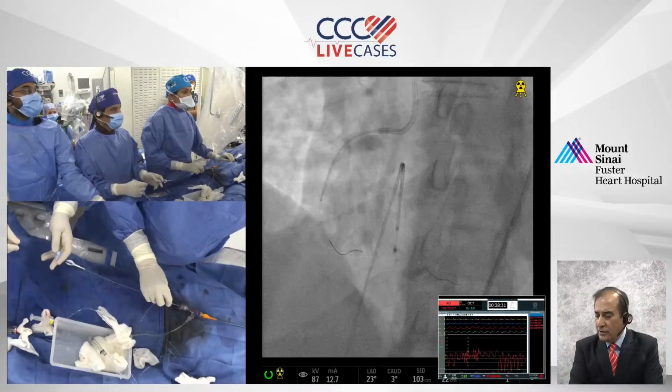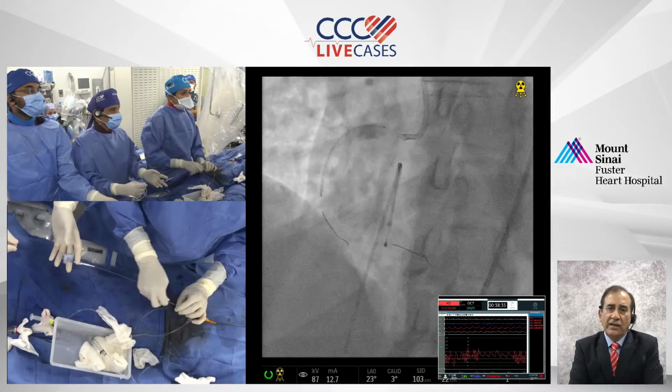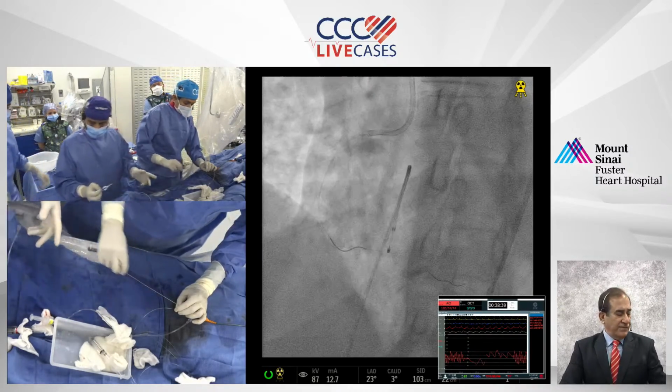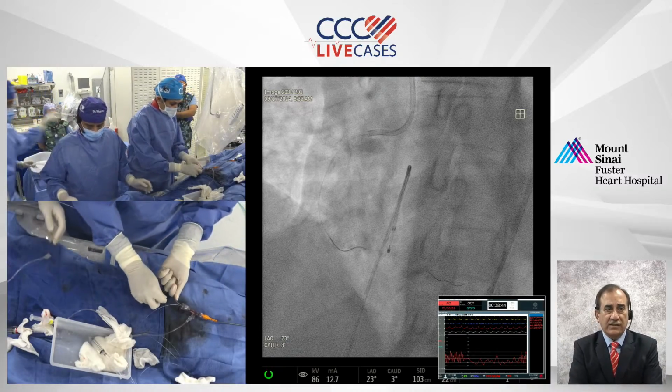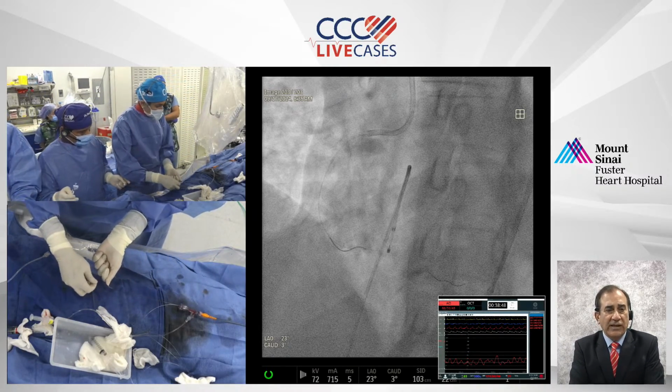I'm sure you are on the right path, but often while talking about and defining the degree of calcification, we are addressing only the superficial calcification. The question is, does the depth also come into play at some stage?